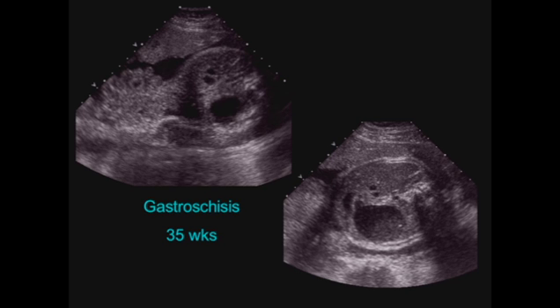So he scanned today after looking at the priors, and he said, you know, it's very different now. The gastroschisis doesn't have any fluid in it. There's no dilated loops anymore. And the stomach is huge. And those are really, really good observations. And so he also noted that the biophysical profile score was 2. The fetus was not moving.